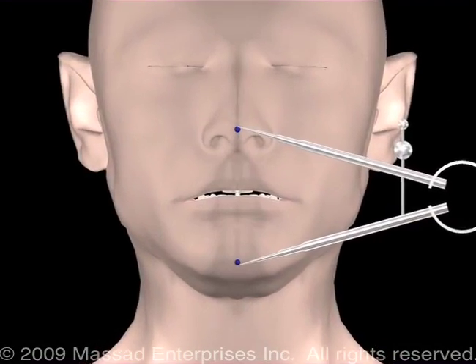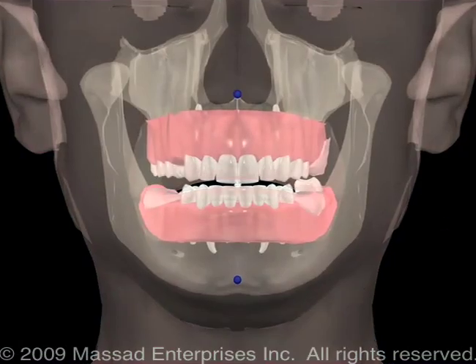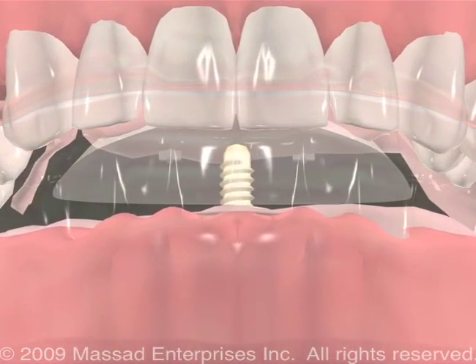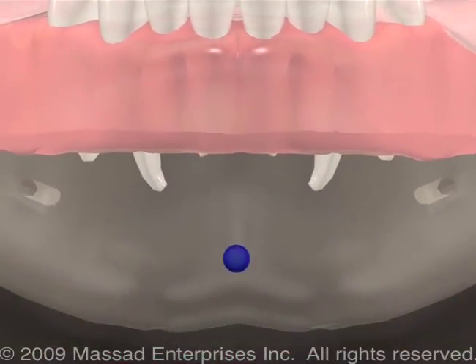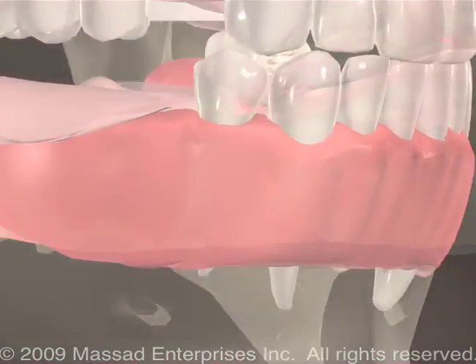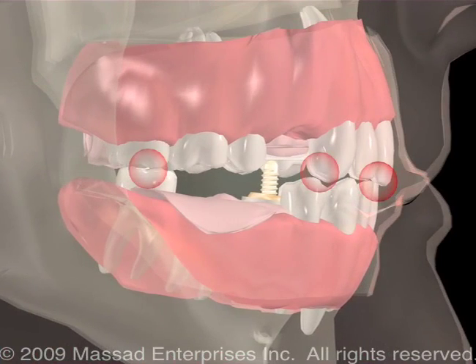If a jaw recorder is going to be utilized on teeth that will be extracted soon, the patient may allow the practitioner to adjust the teeth to allow the jaws to move smoothly. In this case, we are closing the pen to allow 3 millimeters of freeway space. However, the patient has tooth interference.